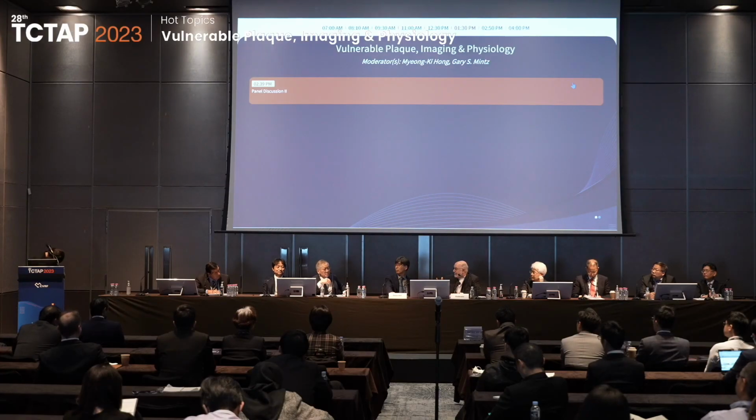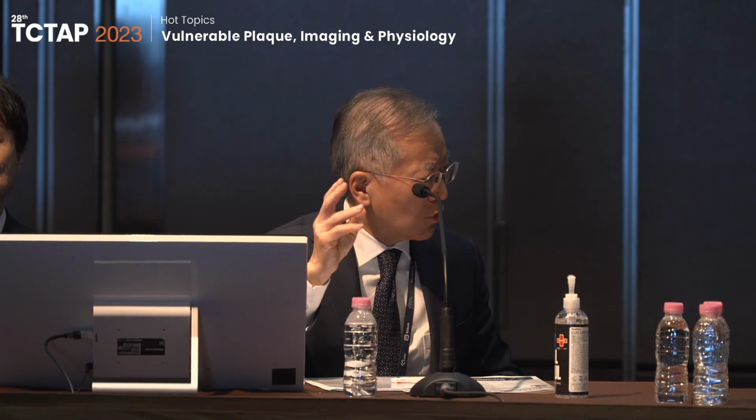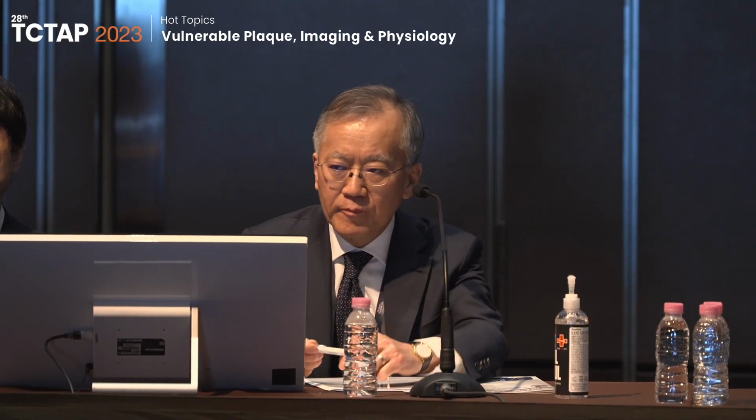I think we have seen a few cases of small plaque, angiographically not evident, that are disrupted if you look at it with OCT: a small plaque with central rupture. When we look into the OCT, intraplaque hemorrhage sometimes, at some point, ruptures, and we see the tiny thrombus by OCT. That goes to the distal vessel, so you may think it's embolic. Yeah, embolic, I accept.